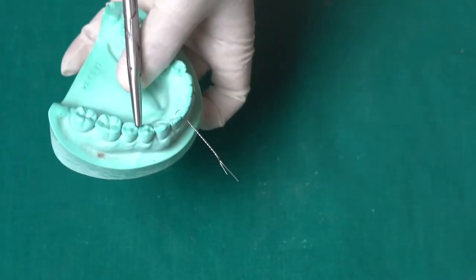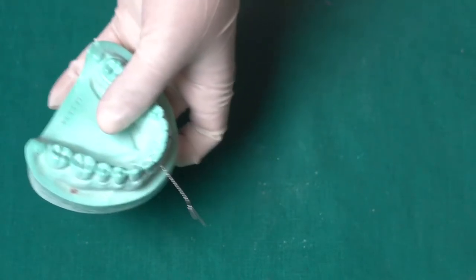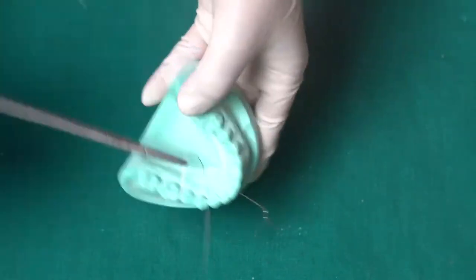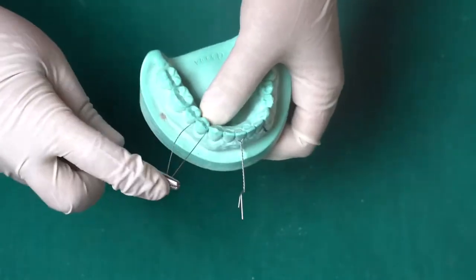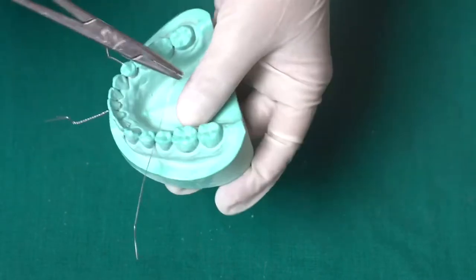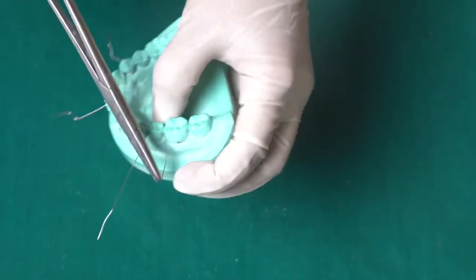Now we are done with the anterior tooth. In the same way, we are going to do this on the premolar tooth selected in the posterior segment of the right side. You can select a molar or premolar — that is up to you. You can see in the video I am doing the same procedure as done on the central incisor. Then again, we are going to do this on the premolar of the left side in the same way.